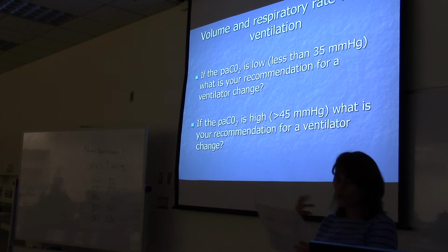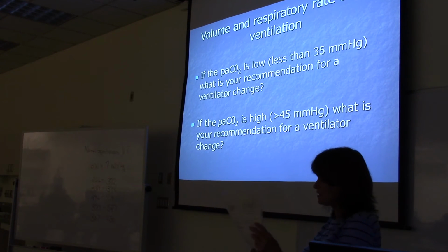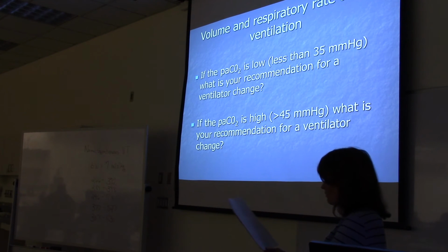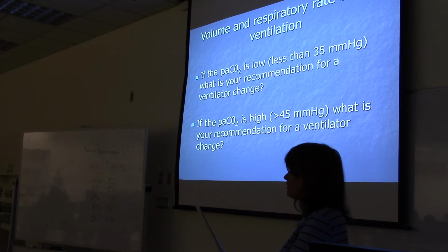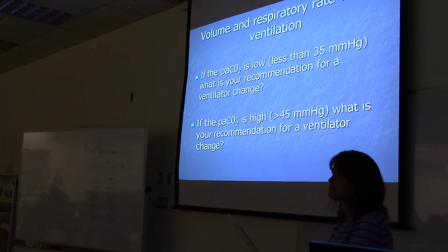And then I have the same question worded all different ways. What if the tidal volume is increased? What effect will that have on minute ventilation? What effect will it have on minute volume if you increase the tidal volume? It'll increase it.